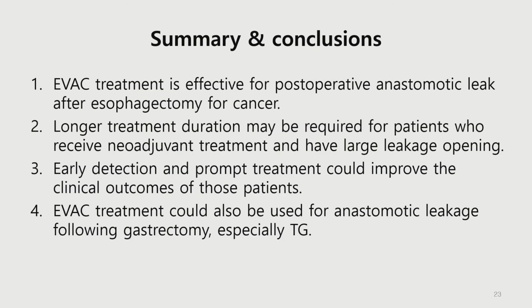Now, I will summarize and conclude today's presentation. Endoscopic treatment is effective for postoperative anastomotic leakage after esophagectomy for cancer. Nonetheless, longer treatment duration may be required for patients who receive neoadjuvant treatment and have large leakage openings. Early detection and prompt treatment could improve the clinical outcomes of those patients.